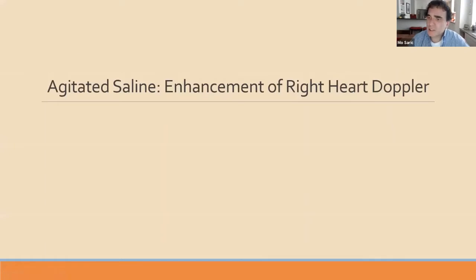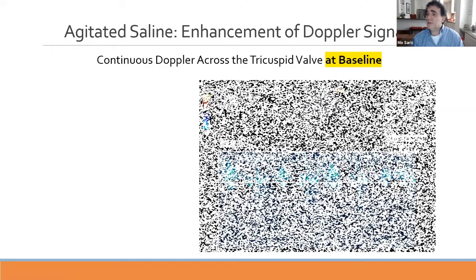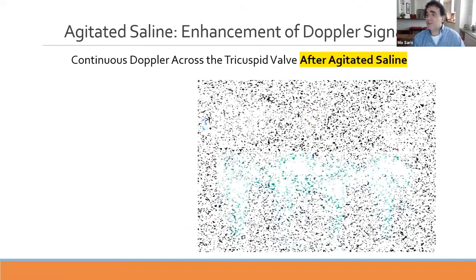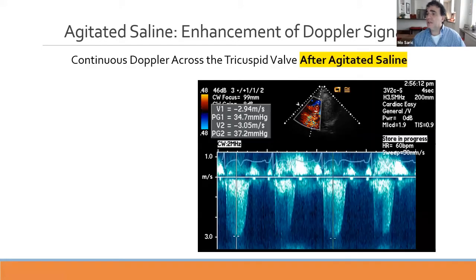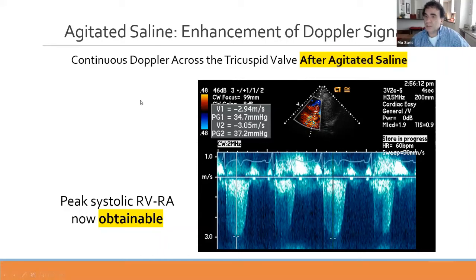Agitated saline can also enhance right-heart Doppler signals. At baseline before contrast, the tricuspid regurgitation jet signal is barely obtainable. After agitated saline injection, the contrast clearly visualizes the TR jet, and now we can confirm the gradient is about 35 mmHg between the right ventricle and right atrium across the tricuspid valve.